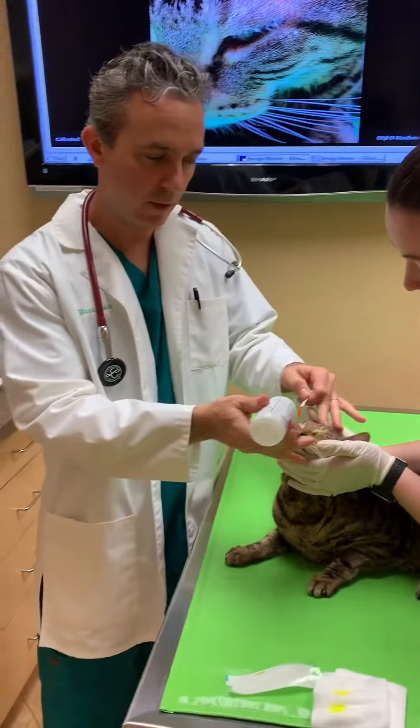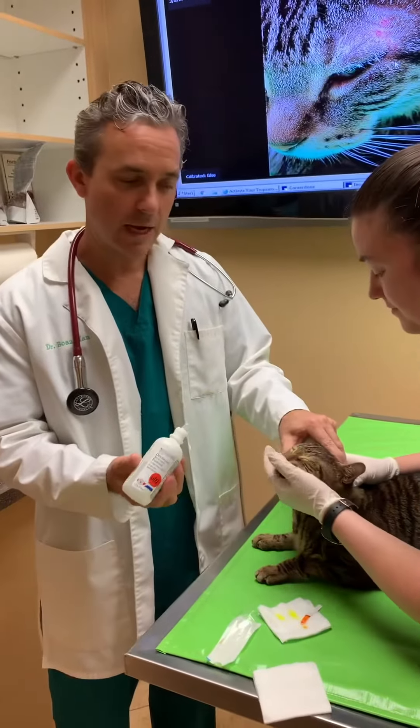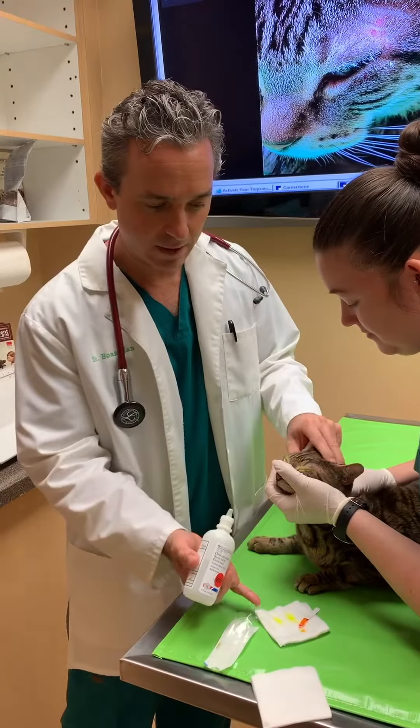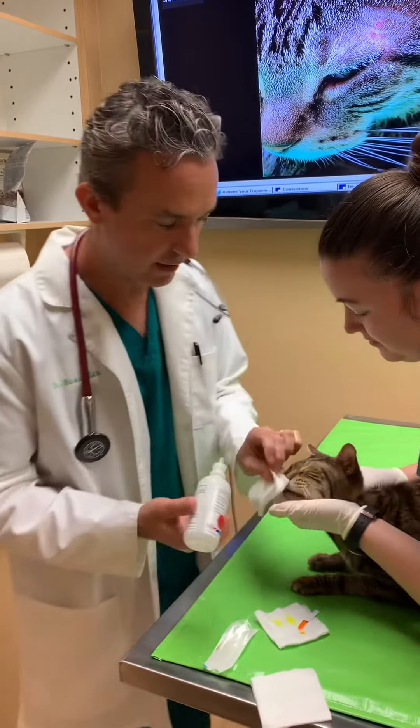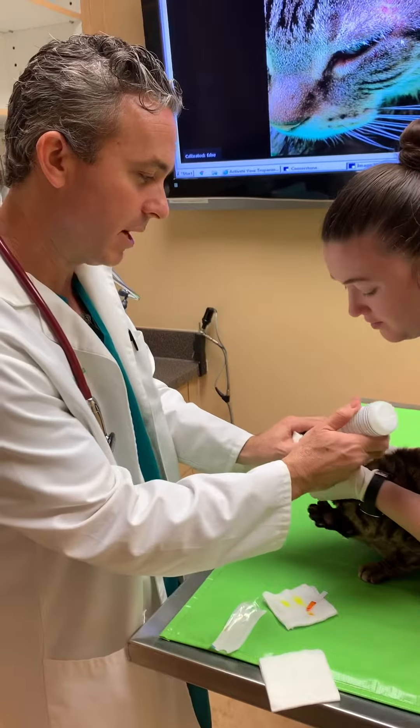He might jump a little bit because it's a little bit cold, but it doesn't hurt him. Now you can see there's a bright yellow here around his eyes, and we're going to continue to wash out his eyes a little bit.